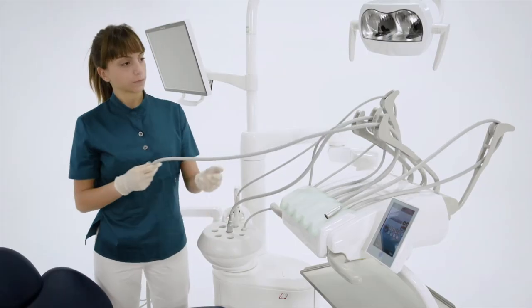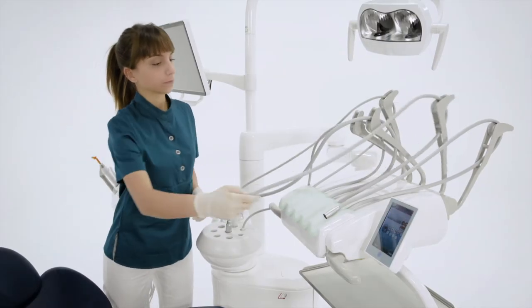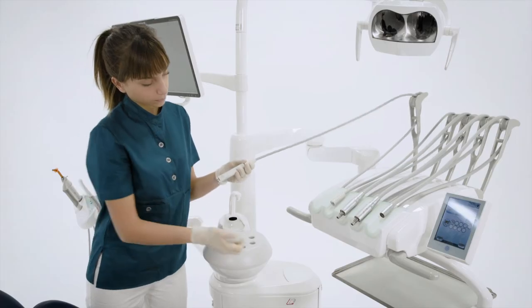At the end of the flushing cycle, the assistant takes the instruments from the tub and places them back in the dentist's module.